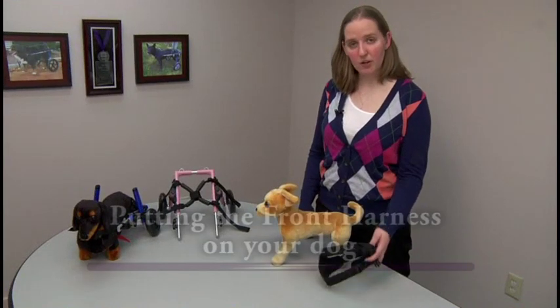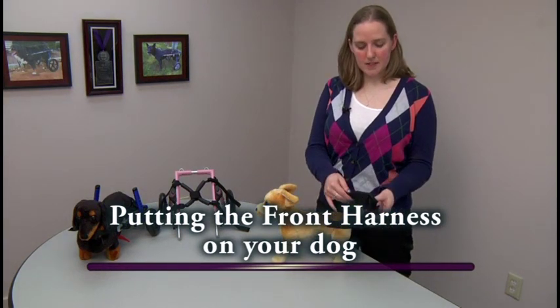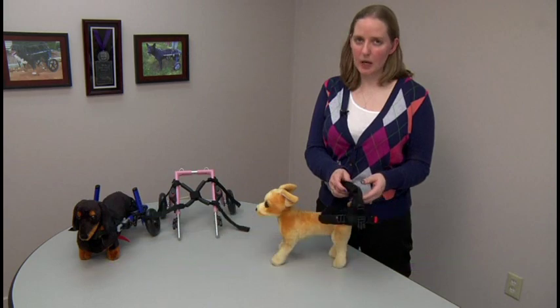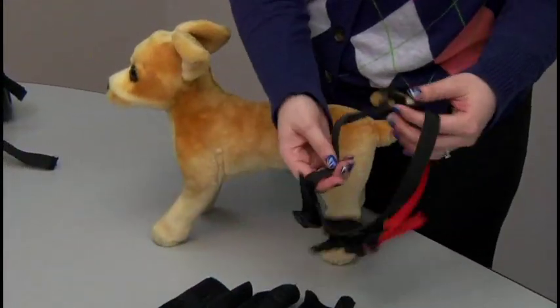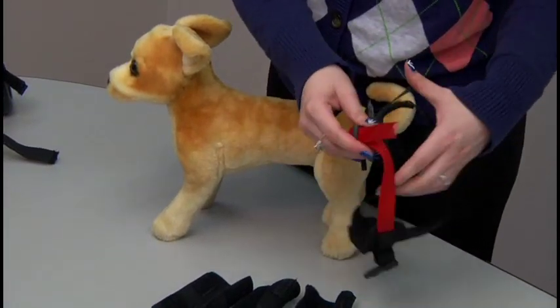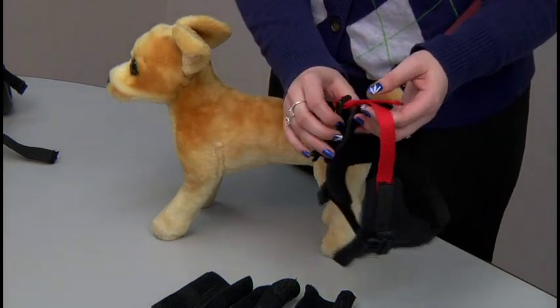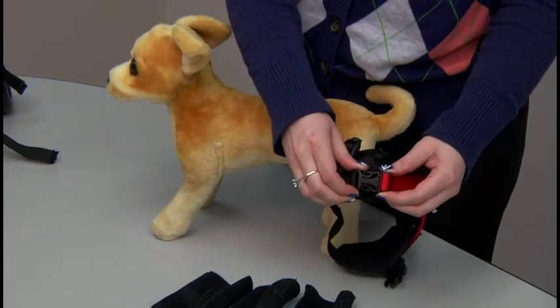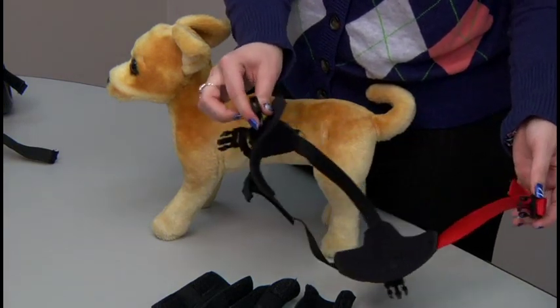Now we will go over how to put the front harness on your dog. Before adjusting the front harness, you do need to take the neoprene sleeves off — it makes it a lot easier to adjust. Note that there are two black straps and one red strap. The red strap goes behind the dog's front legs underneath the belly area. The red strap also has a buckle on it, which should be unbuckled in order to put it on the dog — it makes it a lot easier.